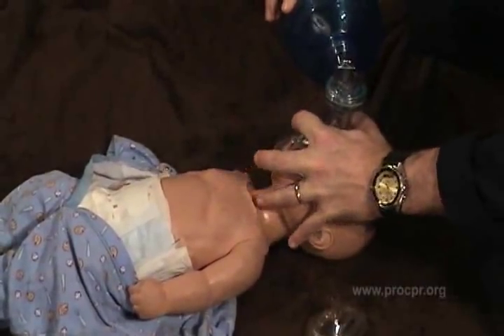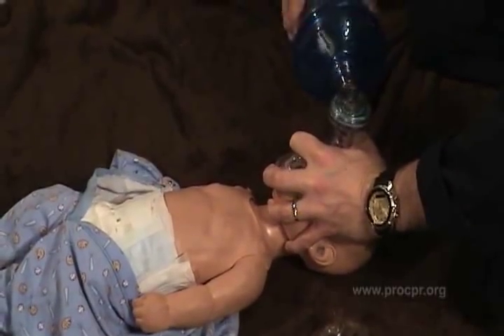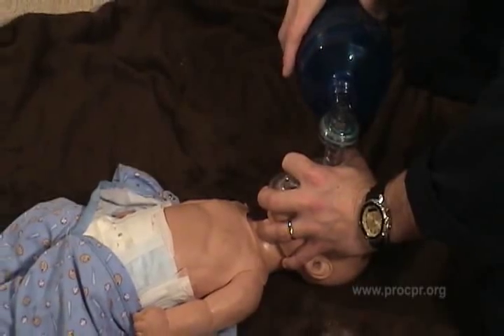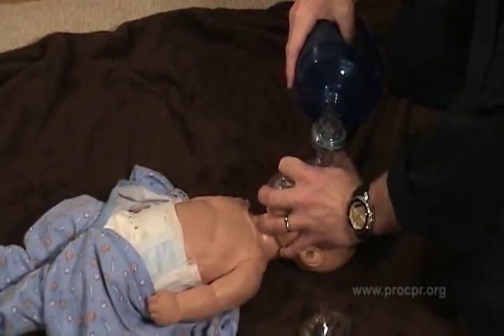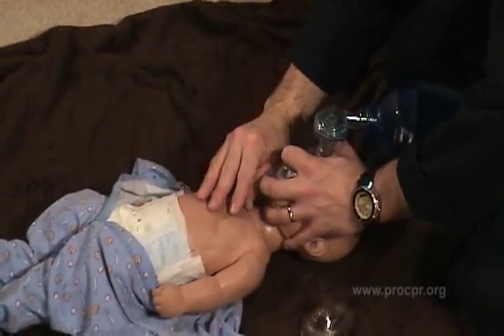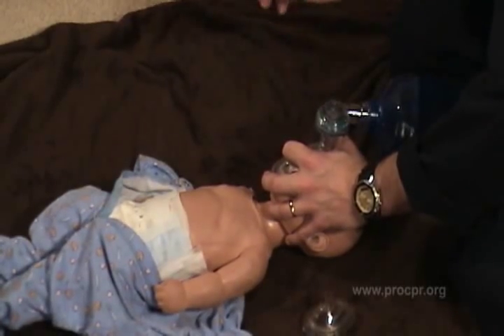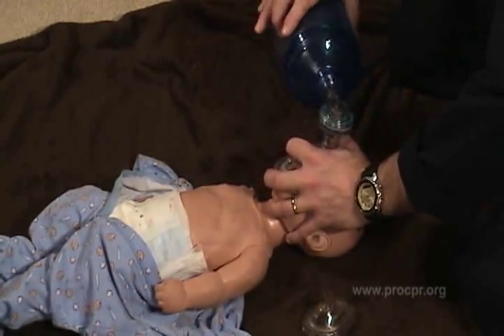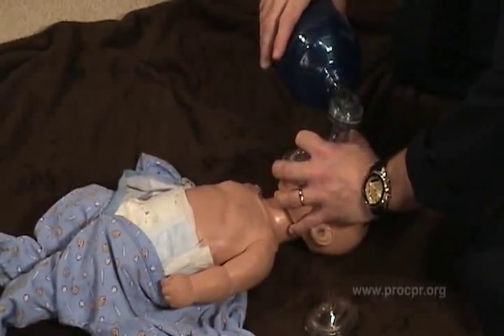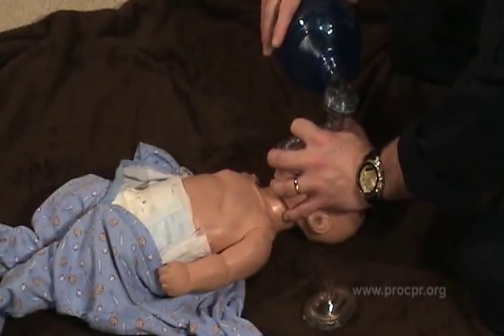Again, CE technique, we bring the baby's face into the mask, and again, we only ventilate until we see good chest rise and fall. When we get resistance after a chest rise, that's far enough. We need to be careful not to overinflate the baby's lungs. We don't want to cause any spontaneous ruptures of the alveoli sacs. I mean, it takes quite a bit of pressure to do that, but we also don't want to fill the stomach with air because we're ventilating the patient too much and it's going into the stomach.